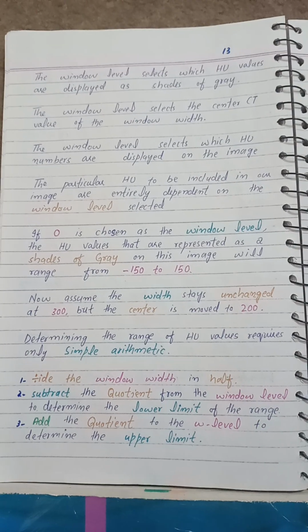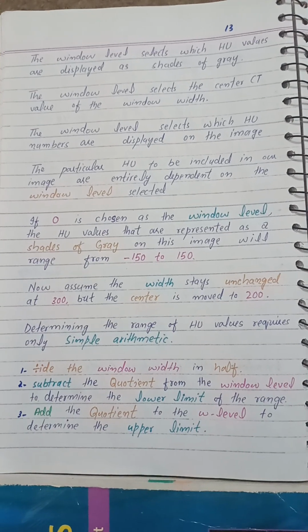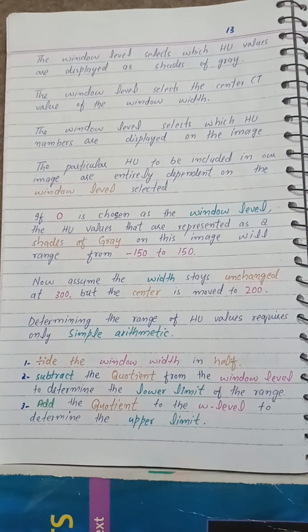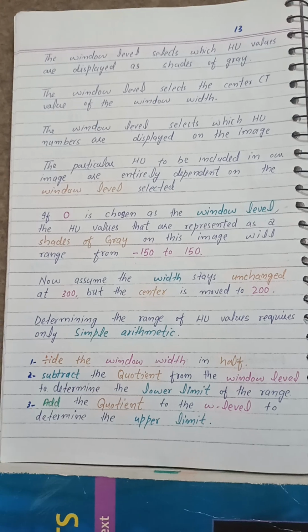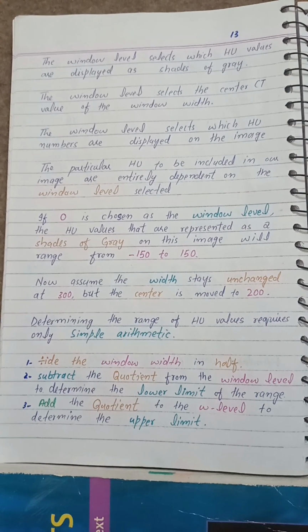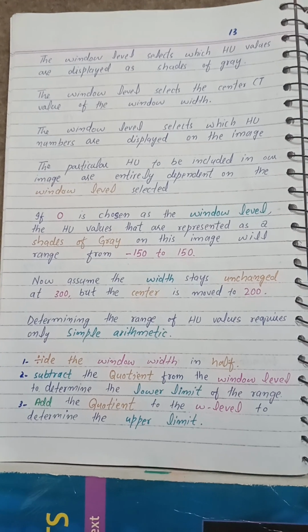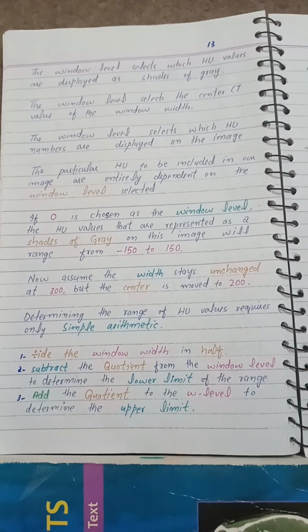The window level selects which Hounsfield unit values are displayed as shades of gray. It selects the center CT value of the window width. The particular Hounsfield unit values to be included in our image are entirely dependent on the window level selected.